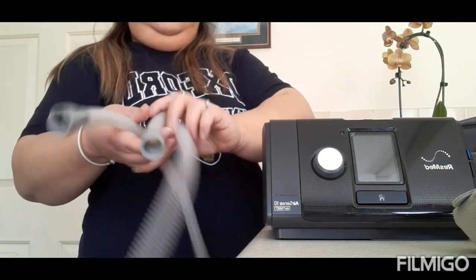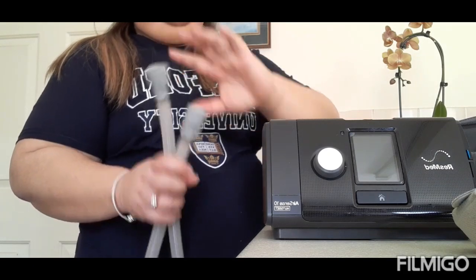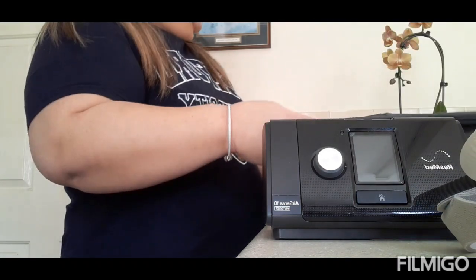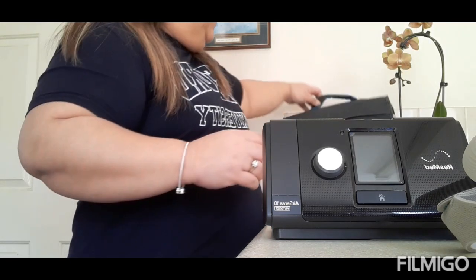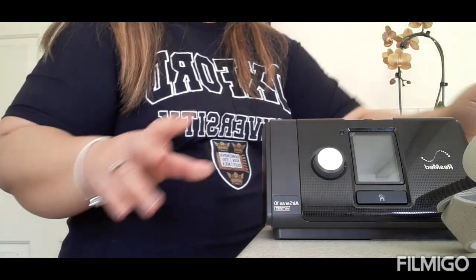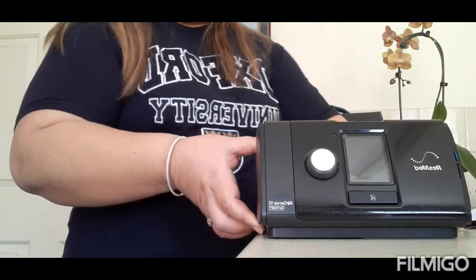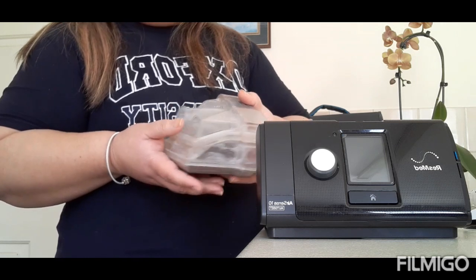This one, guys. And this one is connected to the machine, to your face, so you can have the air that you need. And then, so that's the bag, right? So I'll put it there for now. And then, here's the machine, right? So, you can actually use this like this, or you can actually use the one with a humidifier. A humidifier is like this, guys.